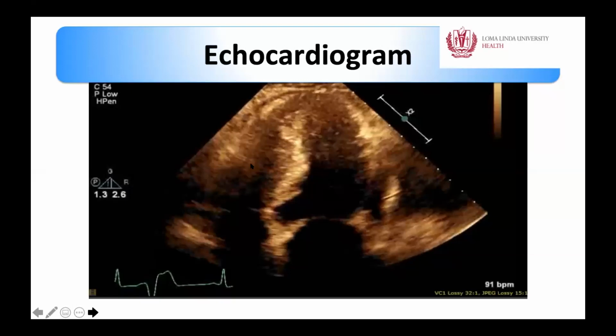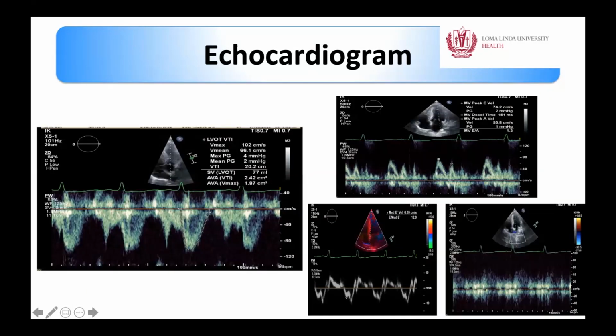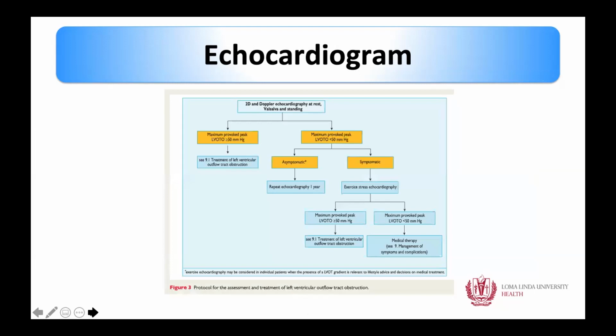Okay, so sure enough, you already guessed this, that there won't be much gradient, and you don't have much gradient. There is some diastolic dysfunction, a pseudonormal pattern, and this is the pulmonary vein pattern, and again, not bad. So it's a young patient, comes with cholecystitis, develops tachycardia. You have figured out now that he has HCM based on this echo.